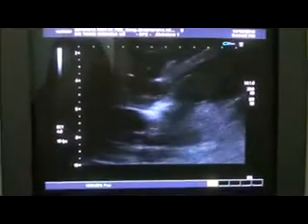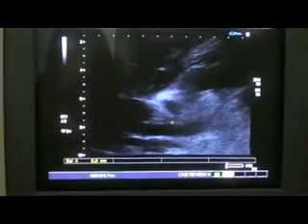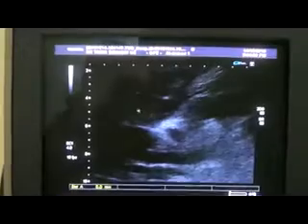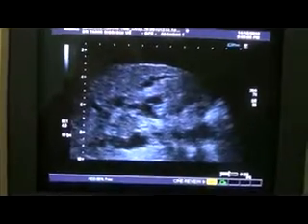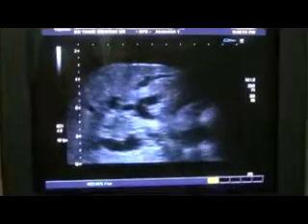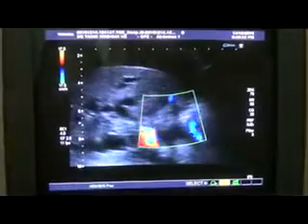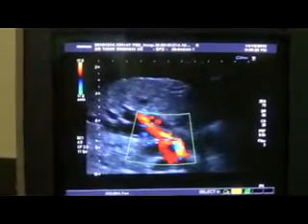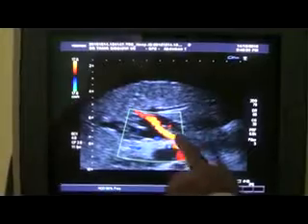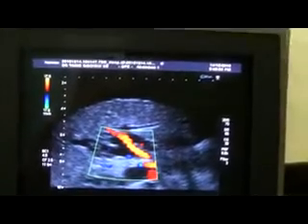From here, again you can see the portal vein and the common bile duct. Once again in this view, the portal vein along with dilated CBD and intrahepatic bile ducts. This focal mass is not that vascular. Portal vein and the hepatic artery. These are the dilated intrahepatic bile ducts. There is no other anomaly.